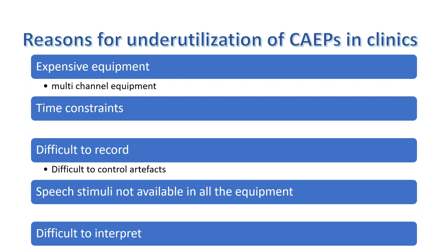Then clinicians feel that it is difficult to record because there are too many artifacts affecting the CAEPs and we don't get a proper response. The speech stimuli are not available in all clinical equipment, though we now have means of recording the speech stimuli and using it in many of the equipment. And another issue is interpreting.